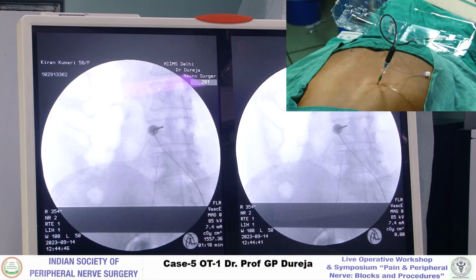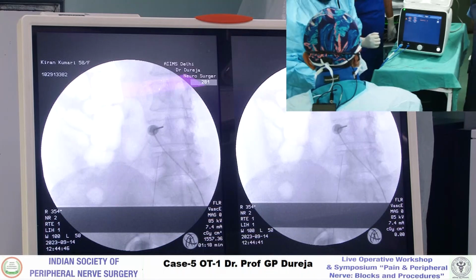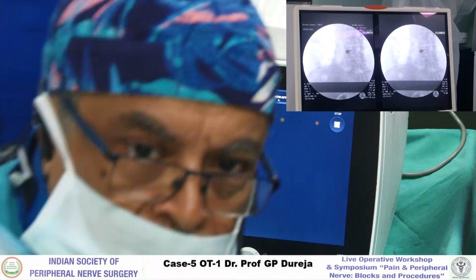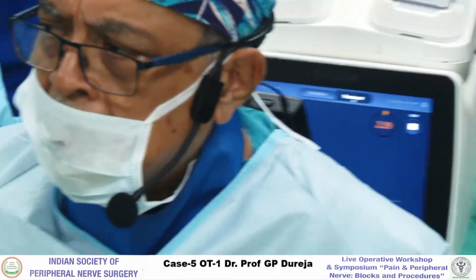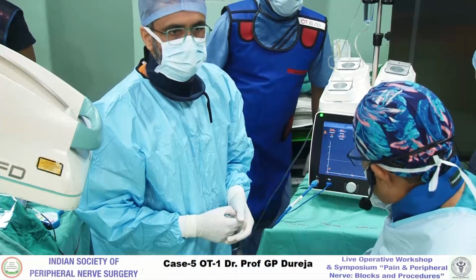आप दूसरे ओटी में चले जाए. हाँ हाँ fix है. Any questions? Yeah. Yes. माइक हाँ. Lesion started. We have started the lesioning.